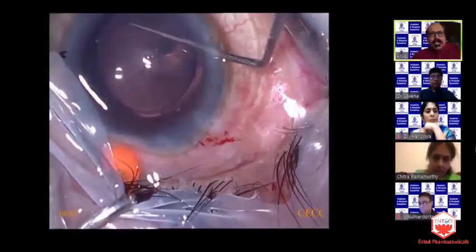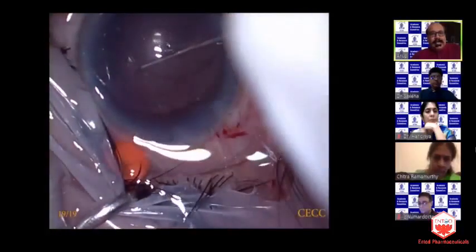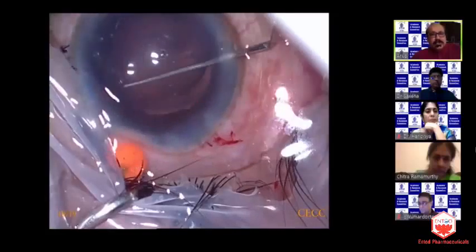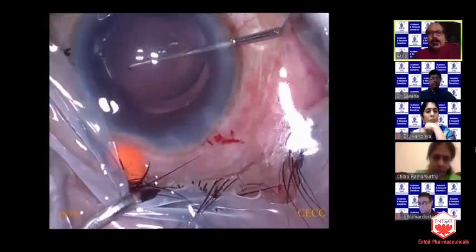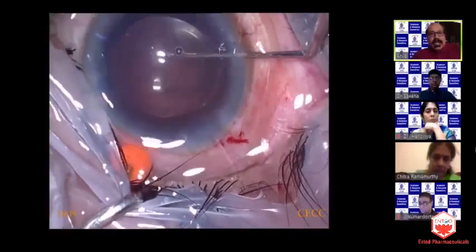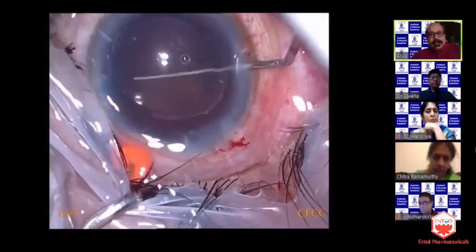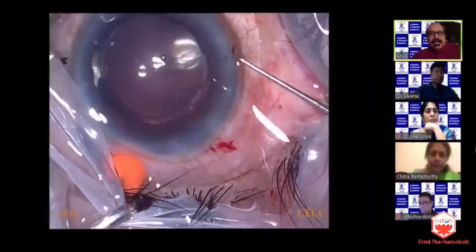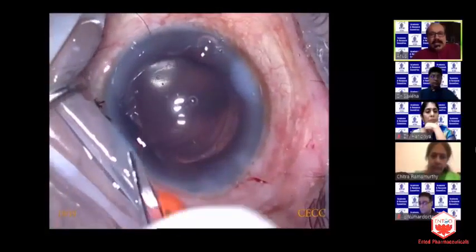So far so good. I implanted an intraocular lens, a single piece hydrophobic acrylic lens, which went into the capsular bag. The eye was sufficiently soft, and I went ahead, and the patient did well. Another option would have been for me to postpone the surgery and take up the patient at the end of the day, at the end of the list, or on another day after giving IV mannitol. But as I mentioned earlier, for some reason, I did not want to postpone the surgery. I wanted to finish the surgery in the same sitting itself.